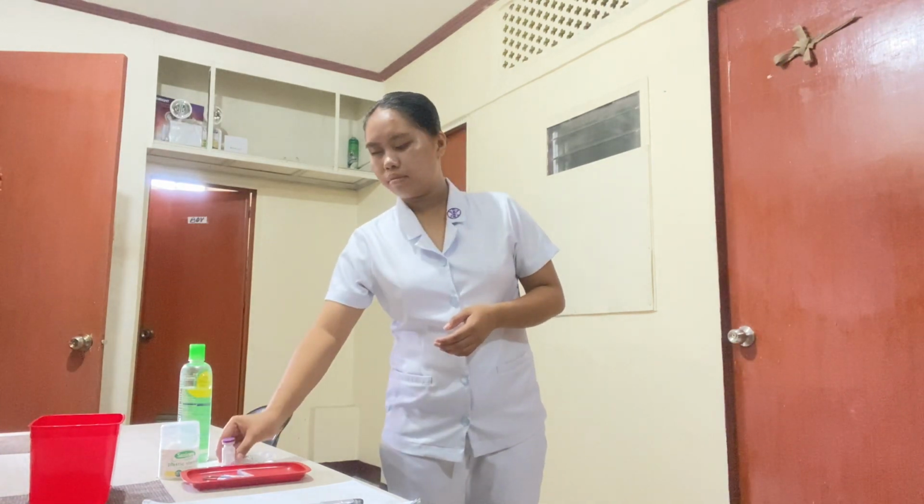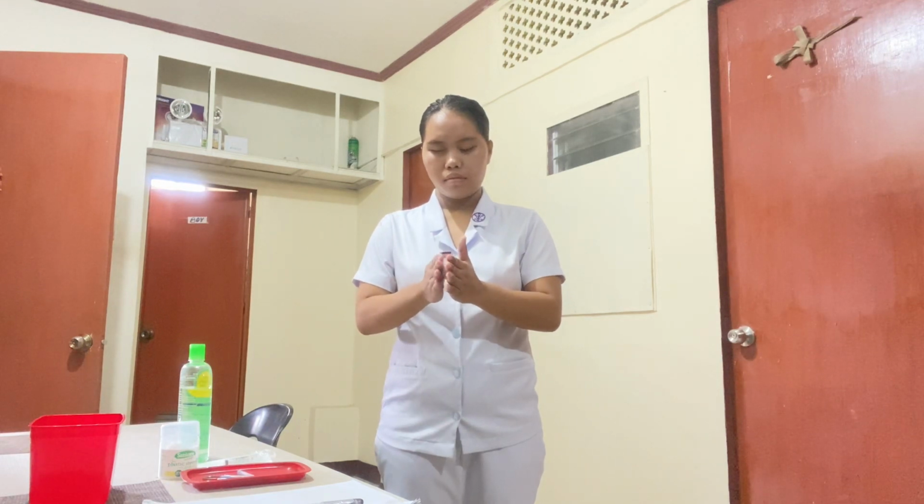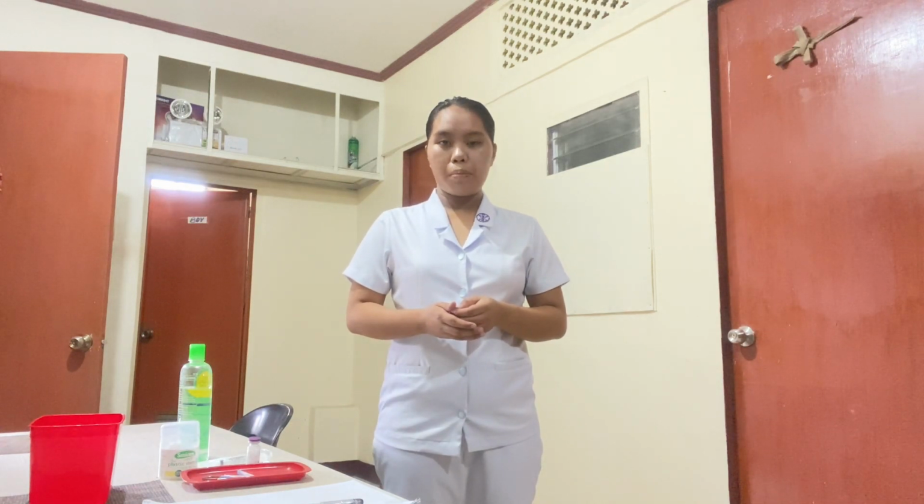Prepare the medication vial for drug withdrawal. Mix solutions if necessary: rotate the vial using the palms of the hands and do not shake it. Remove the protective cap and cleanse the rubber cap of the vial using the antiseptic swab by rubbing in a circular motion.